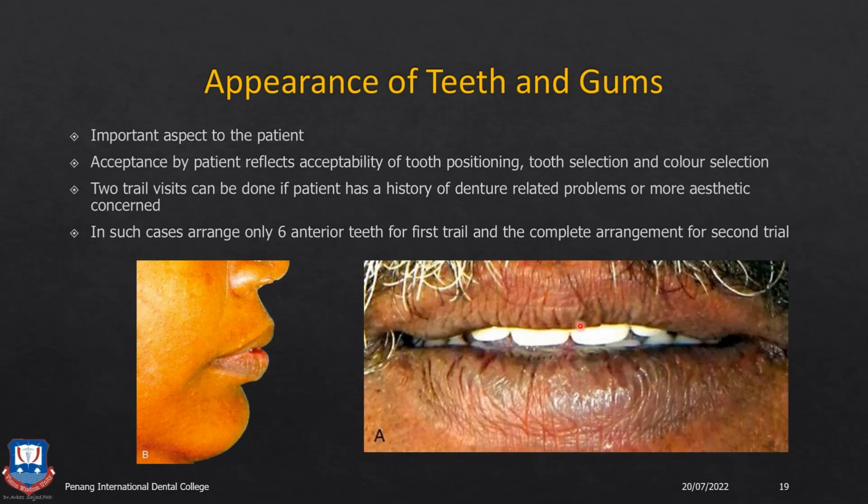So all these things also need to be verified during the try-in appointment. After all, technicalities are not something which the patient is aware of. As far as he is concerned, he just mainly looks for aesthetics and function.